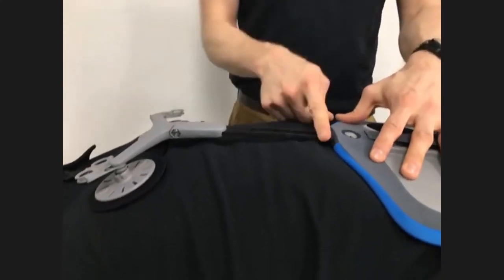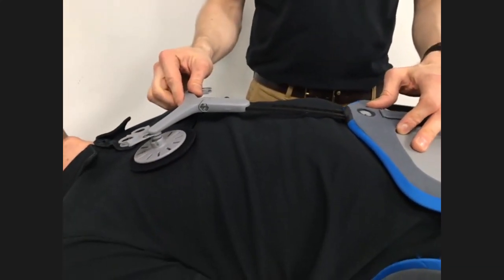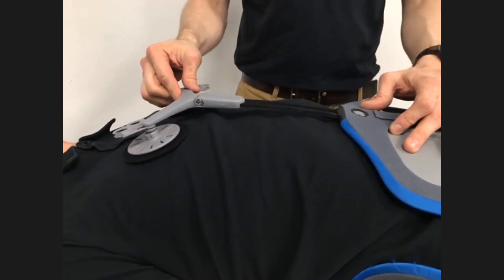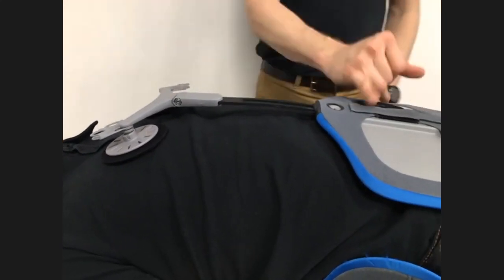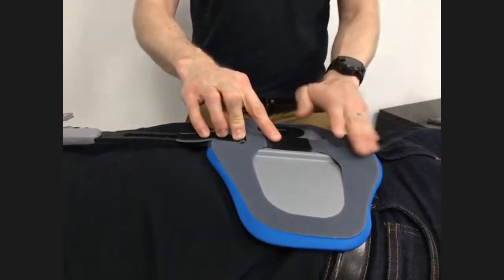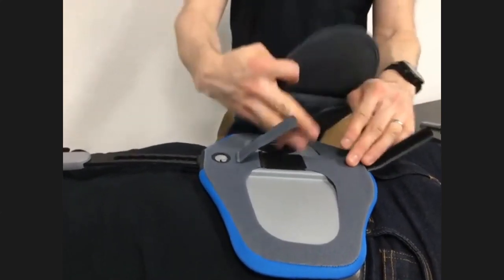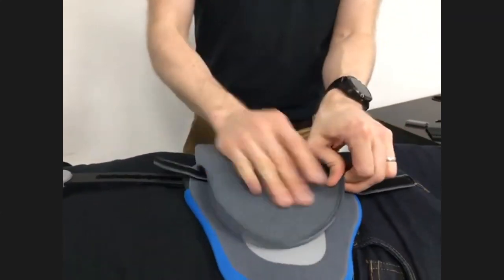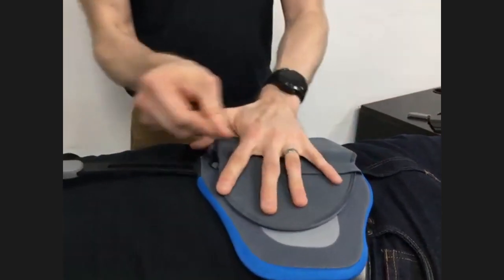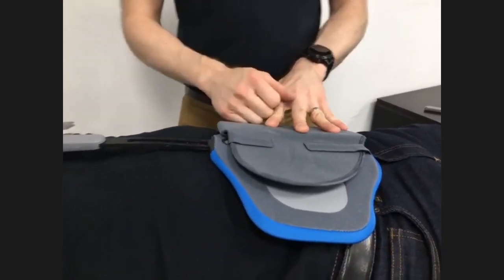So you can see a nice low profile fit across the top, and it's nicely in position so that we've got it in the correct place. Now when we come to connect the belt onto here, again, a very simple system. We undo these two tabs either side. You can also see there's a large piece of Velcro here. Bring the belt over like that, fasten that into position, and it means you can contour it.